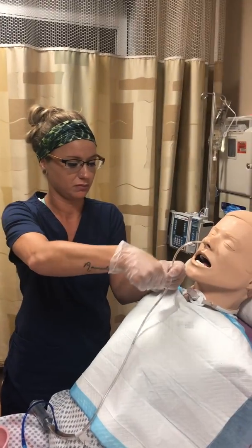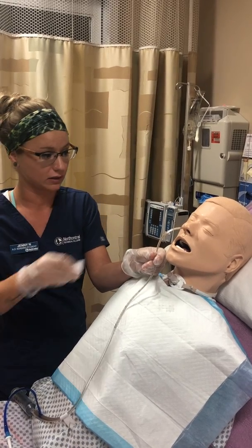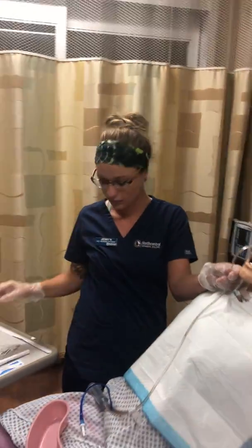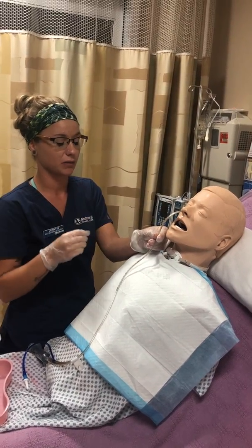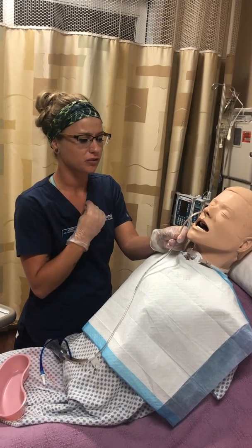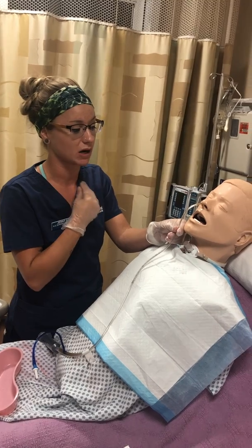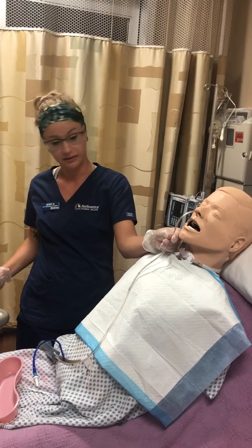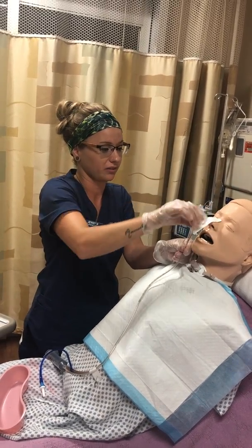I guess I forgot my alcohol prep for securement, so I will hold my tube and I will not let go. While that's drying, I will just verbalize, if for some reason as you're advancing it you hit a restriction and you're not being able to advance it any further, withdraw slowly and visualize through the mouth. Maybe your tube is recoiling in the back of the mouth and you may need to retract it.